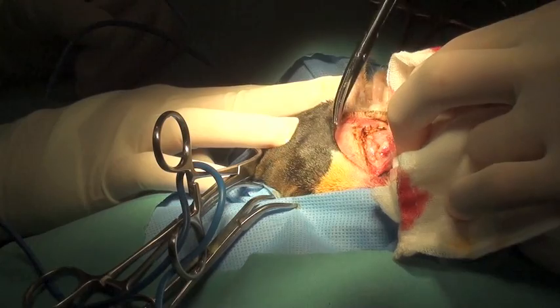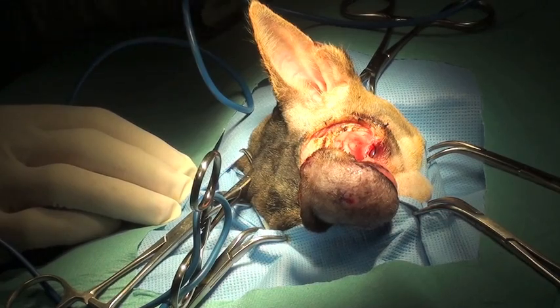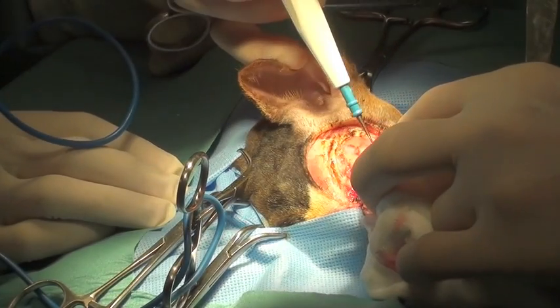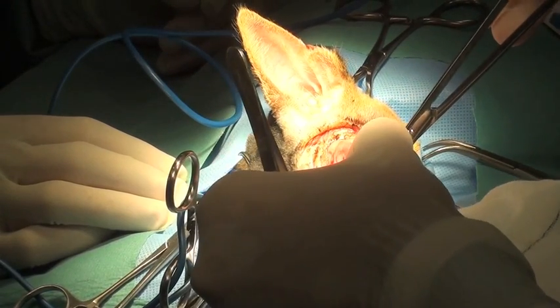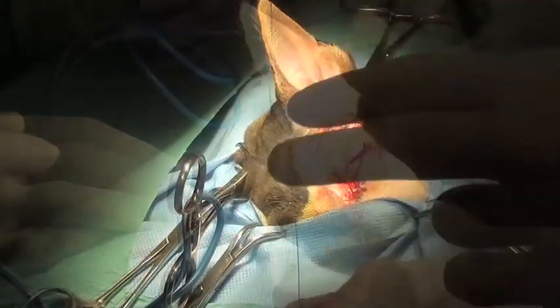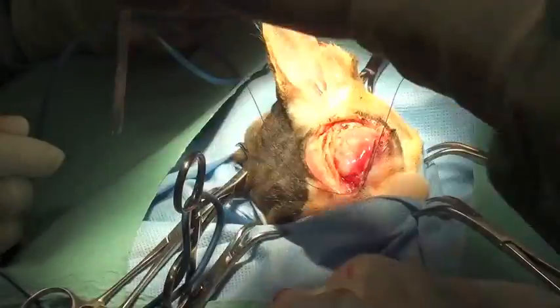The majority of the conjunctiva is preserved, making sure to remove any conjunctiva that might be infiltrated with tumor. So you normally reconstruct that conjunctiva onto the mucosa of the lip? The medial canthus is reconstructed using interrupted sutures.